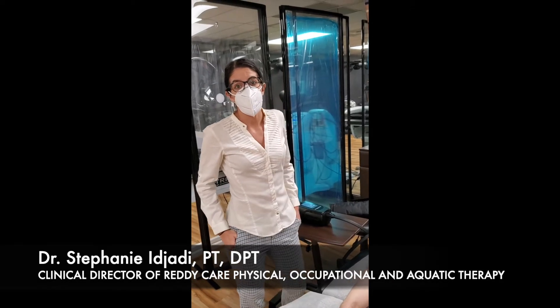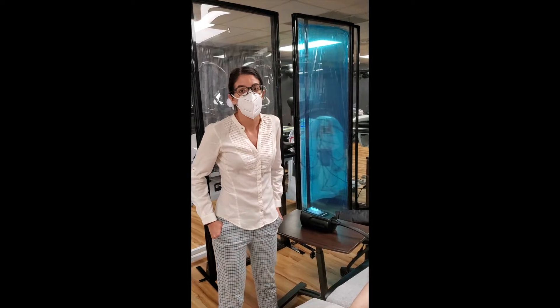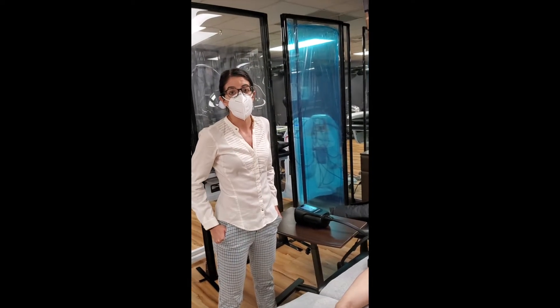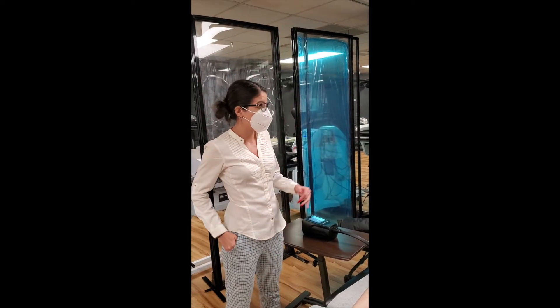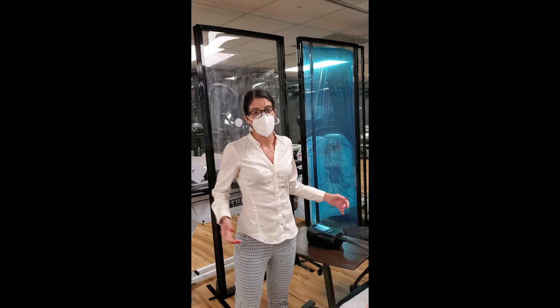Hi, my name is Stephanie. I'm a physical therapist and the clinical director of ReadyCare's Great Neck location. I work a lot with lymphatic patients, and one of the great new technologies we got is the NormaTec for the upper extremity.